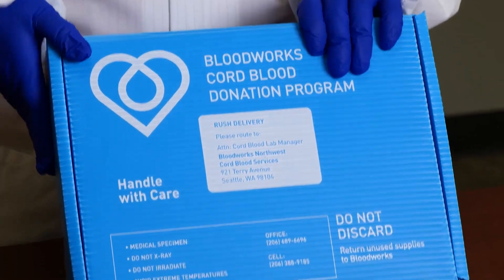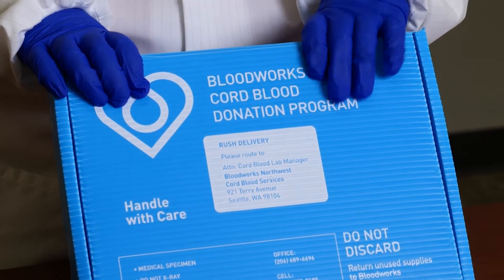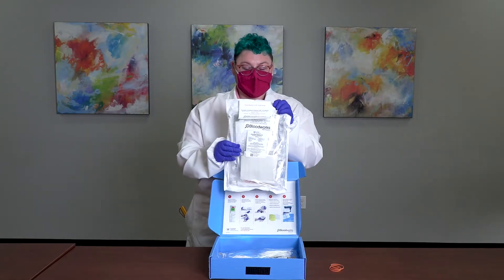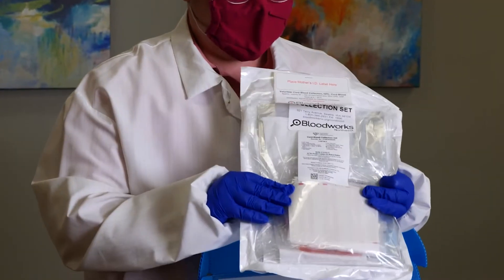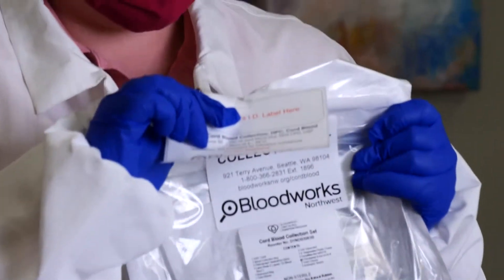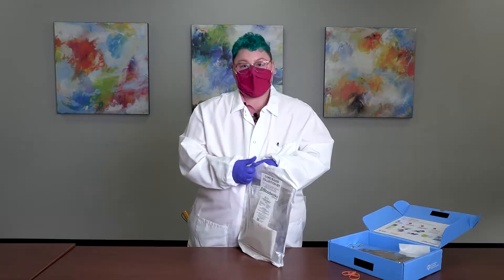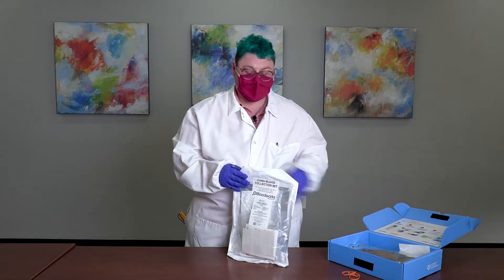Now we're going to go into the Cord Blood Collection Kit. For either a vaginal or cesarean delivery, you'll want to collect one of these kits. It includes packaging that will need to be returned to the Bloodworks Cord Blood Program for processing. Inside the box, we have the collection set, which includes supplies for your maternal samples as well as the collection bag for vaginal delivery by Fresenius Kabi. On the outside, we have the base label — set this aside somewhere you won't lose it, such as inside the box.